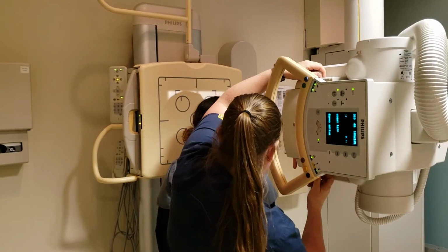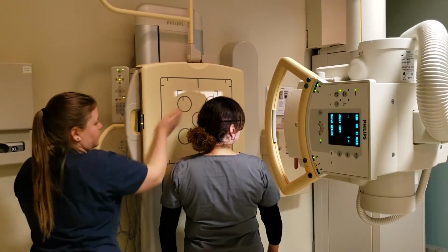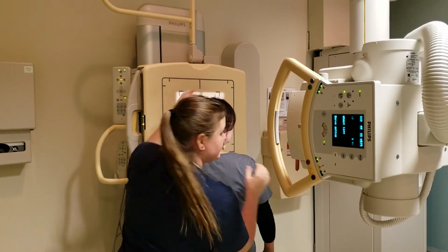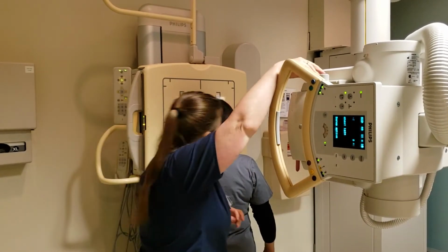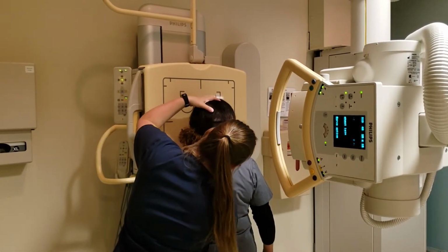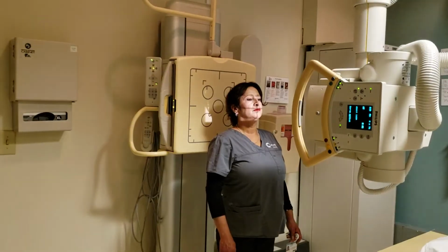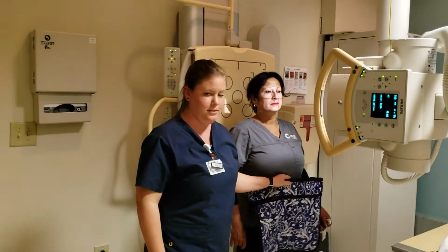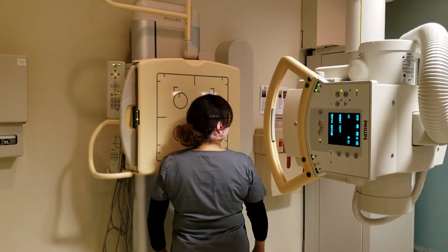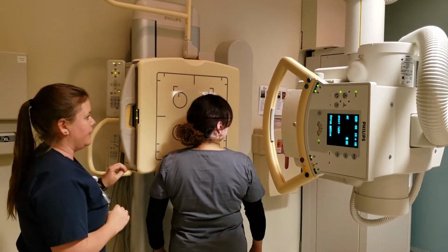Just coning in to get the sinuses. And my left marker will go over there. Alright, a little bit closer to the board. And to your head here. Perfect. Okay, so the IOML is going to be parallel with the IR. And she's going to have suspended breathing. Throughout all of them, she's been wearing this shield. So I'll just ask her to hold her breath, take an x-ray, and then you can breathe. The technique I used for that one is 70 at 8.